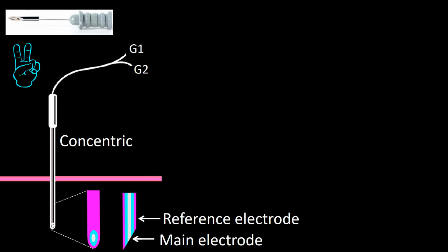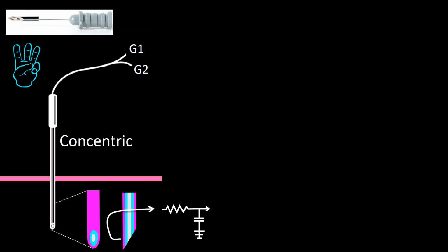The slanted electrode tip produces an ellipse recording area, unlike the cone-shaped recording area of the monopolar electrode. The proximity of the main electrode to the cannula, which, as we previously mentioned, serves as a reference, brings stability to the recording, and the extension of the cannula on one side shields the active surface of the main electrode from high-frequency waves generated by muscle fibers on the cannula side of the electrode.